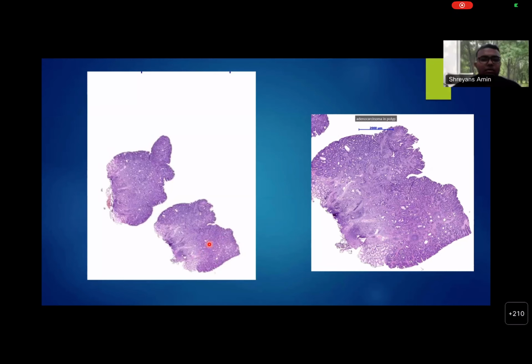Right. So can you guess what kind of polyp this could be in the rectum? Like we just said, epithelial, neoplastic, non-neoplastic. And in neoplastic, is it an epithelial polyp or non-epithelial polyp? Yes, ma'am. This could be an epithelial polyp. Correct, because you are seeing all these tubules here and then some villous architecture as well. So most likely it is an epithelial polyp. To further classify it, what would you require? To further classify the epithelial polyp, ma'am, I have to see the architecture, whether it's villous architecture, tubular architecture, or tubulovillous architecture. Here you can see that there is a small proportion of villous architecture. Most of it is tubular.